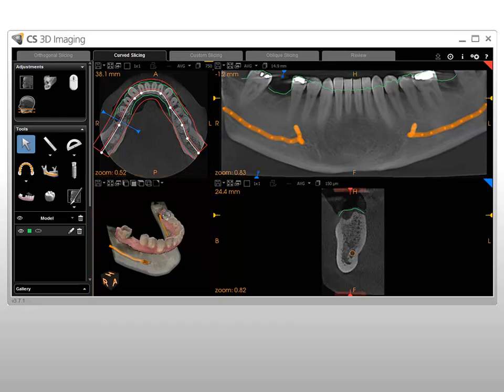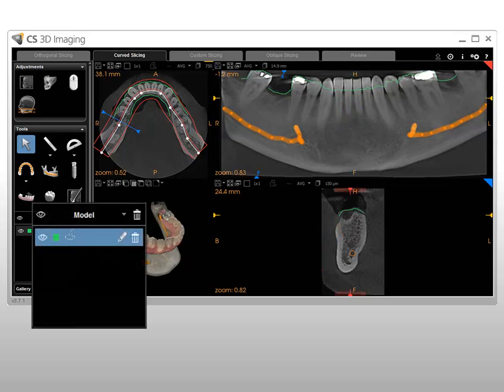The outline of where the model's soft tissue meets the slice panes is displayed as a green line in the following view screens: axial slice view screen, reconstructed panoramic view screen, and oblique coronal cross-section view screen. The model appears in the Object Management panel.